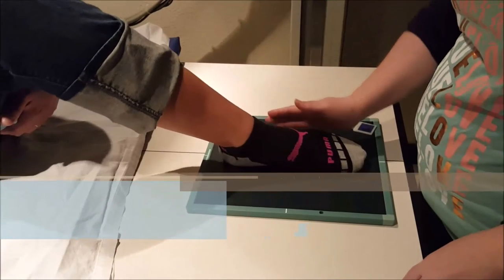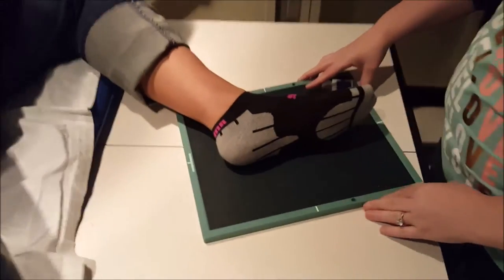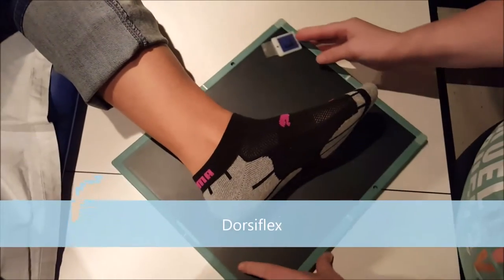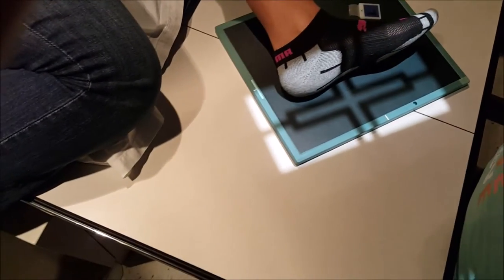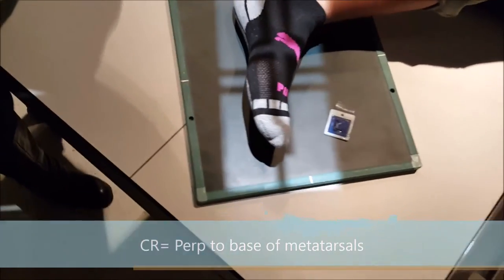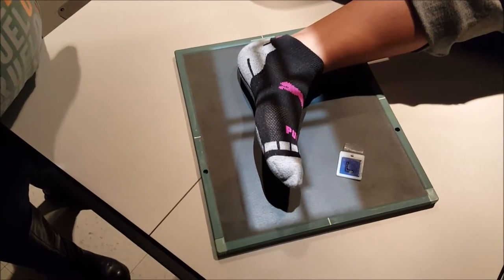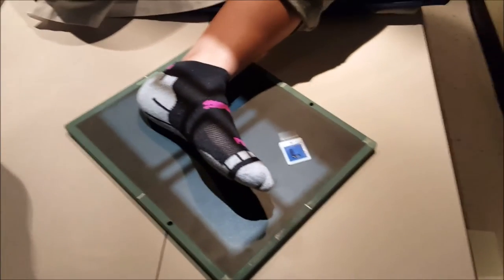For the lateral foot, you're going to have the patient put the lateral aspect of their foot against the IR. You're going to have them dorsiflex their toes. We're going to have her bring her knee up just so that her metatarsals are all going to be superimposed over one another. There is no angle, so you're going to be perpendicular to the base of the third metatarsal, at the level of the third metatarsal.